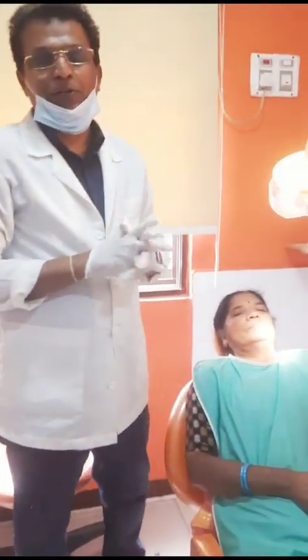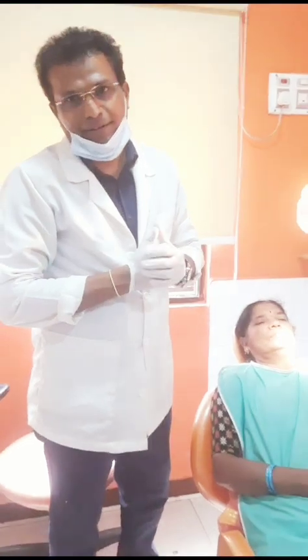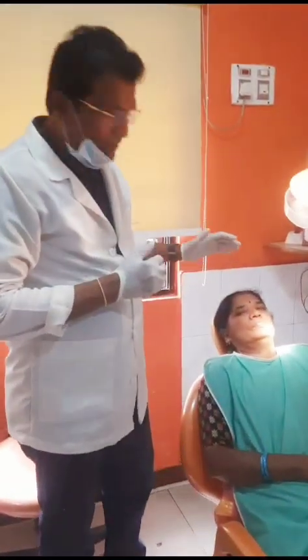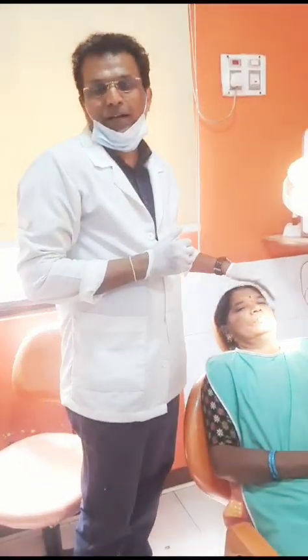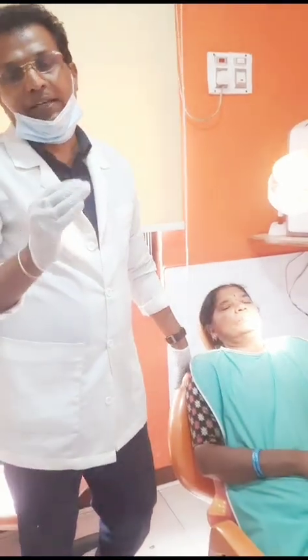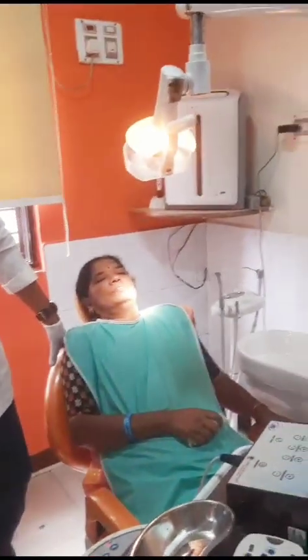Today I am very eager to share a new case of basal cortical implants. This is my patient and she has a lot of trust in me. She has agreed for the basal implants in the region of 36 and 37.